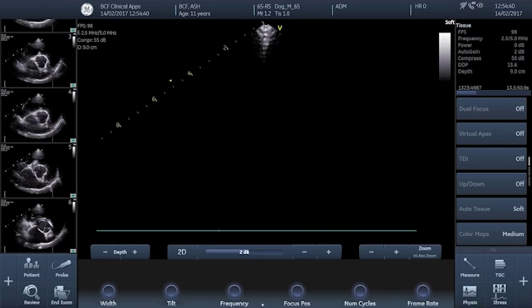In order to make these measurements the first thing we need to do is to acquire the appropriate view, and in the case of the LAAO ratio the appropriate view is a right parasternal short axis view through the base of the heart at the level of the aortic valve.